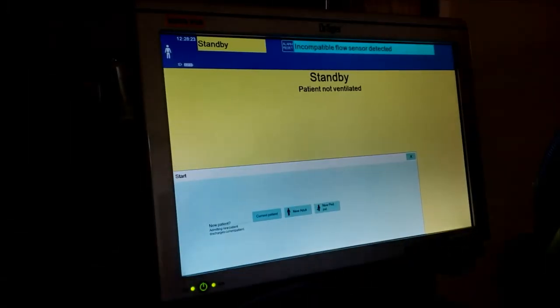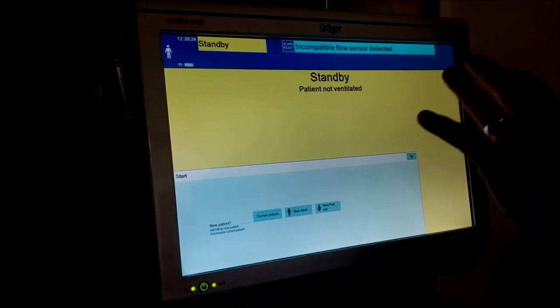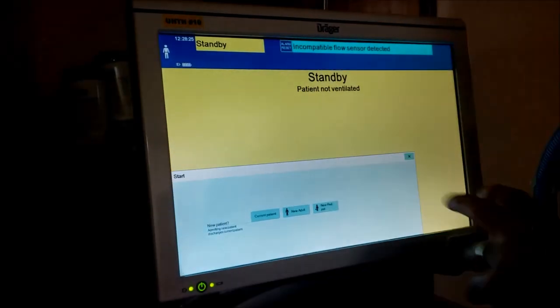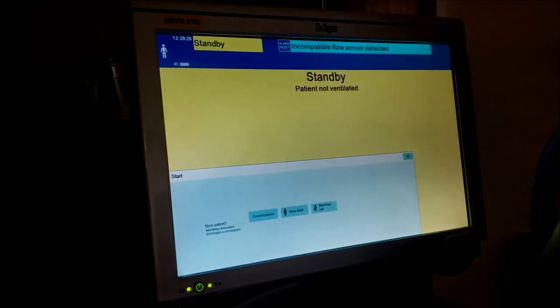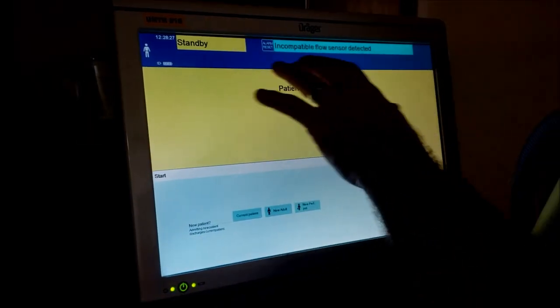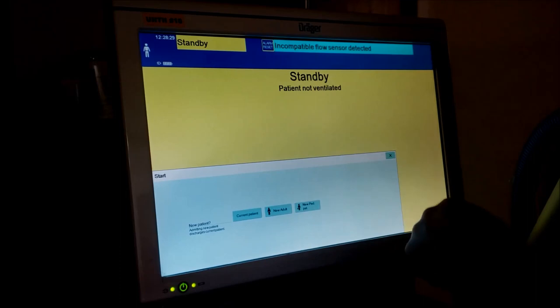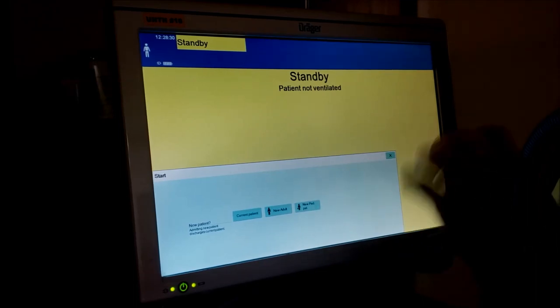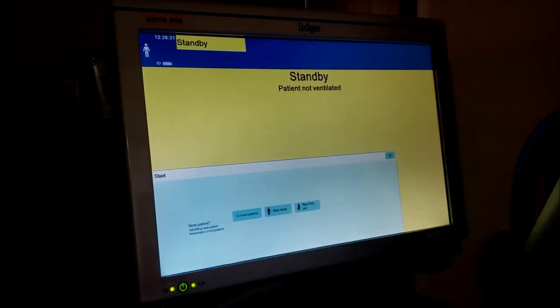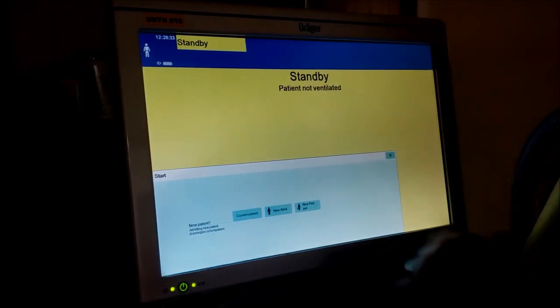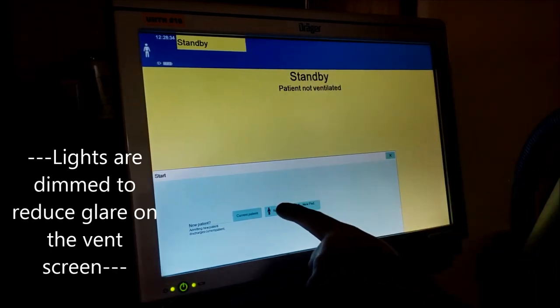Alright so let's get started. This is the main screen when you turn the ventilator on. It'll have alarms across the top. This can be quickly reset - it's incompatible flow sensor but that's absolutely fine. Go to new adult.